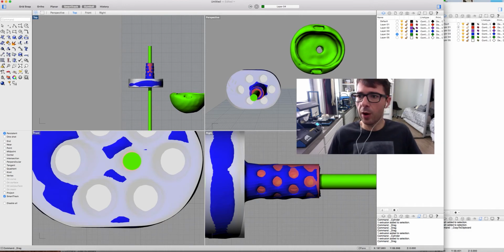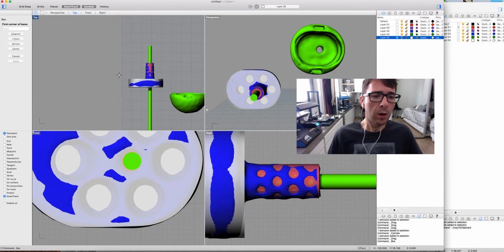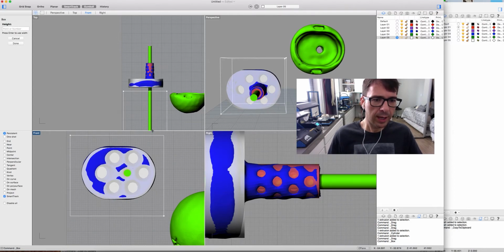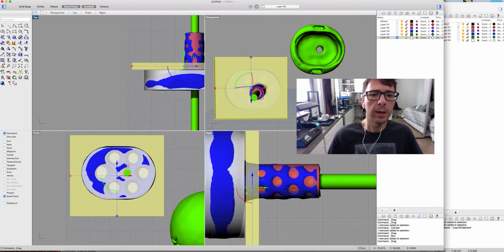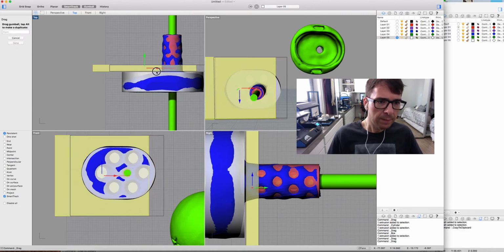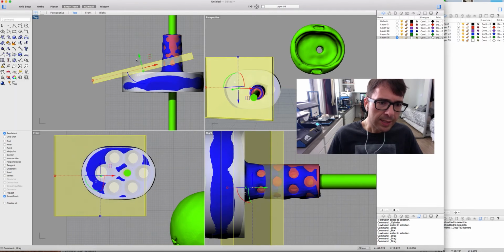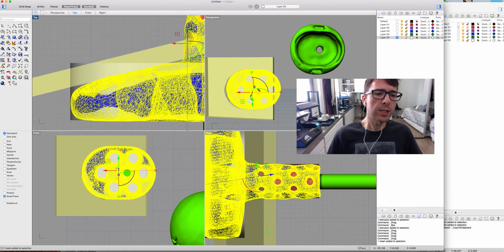So let's draw a square. Okay, let's draw a box here. Over the implant, we're going to draw in this view, just like that, and it can be no problem. Now we are going to put it here. Let's move around there, and we are going to angle it just close enough. Here we can see it's close enough to the real implant.